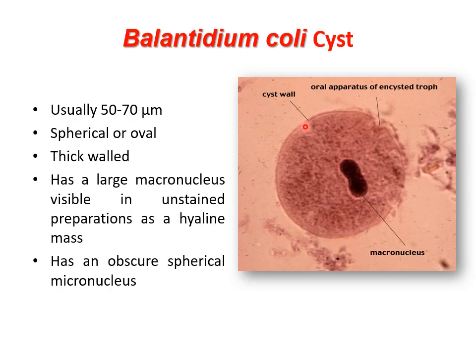However, the characteristic of the cysts of Balantidium coli is the size. The cilia might be seen at the inner side this time because they're retracted to the internal surface, but more prominently we can see the macronucleus even in unstained preparation. And remember that for Balantidium coli, the diarrhea resembles that of Entamoeba histolytica, so we can see blood and pus within the stool.